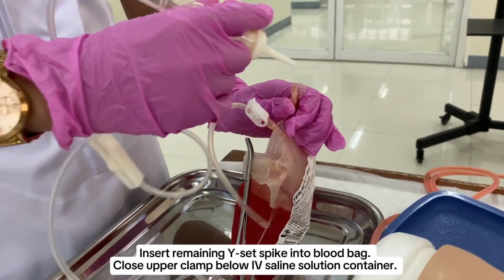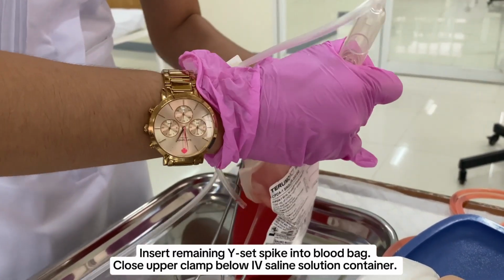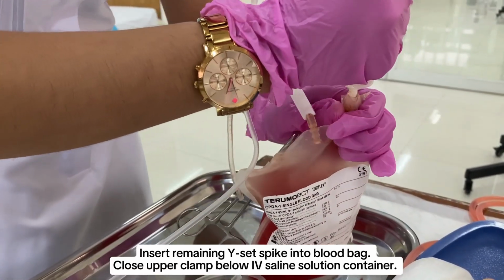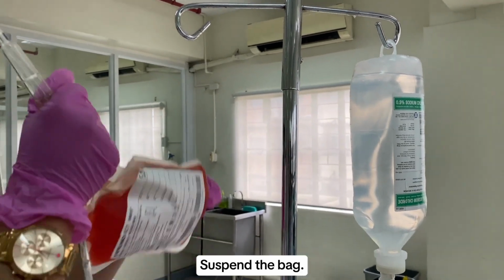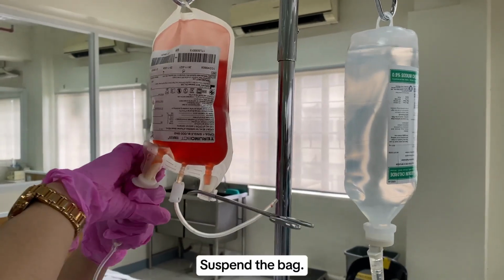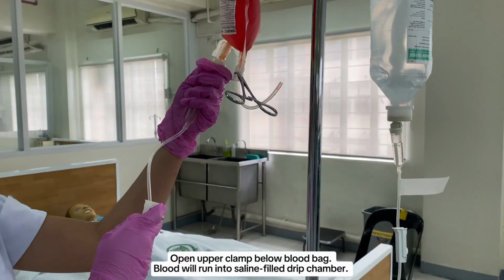Insert remaining Y-set spike into blood bag. Close upper clamp below IV saline solution container. Suspend blood bag. Open upper clamp below blood bag.